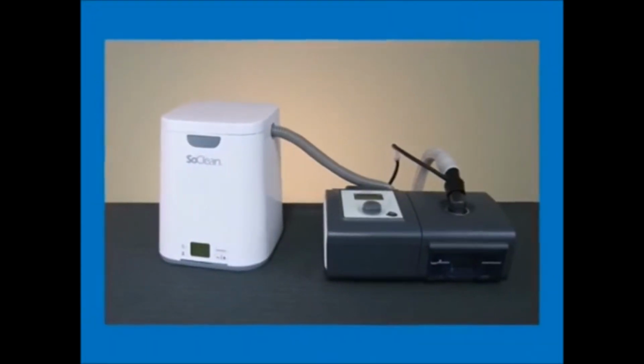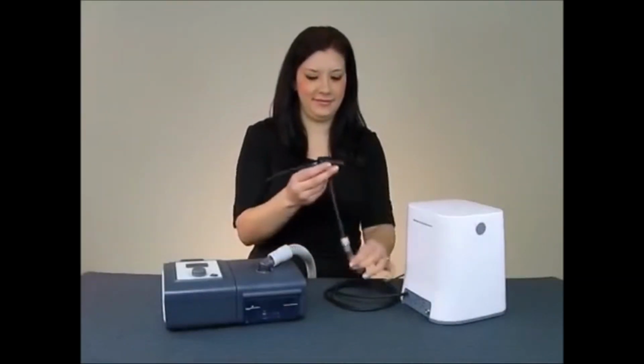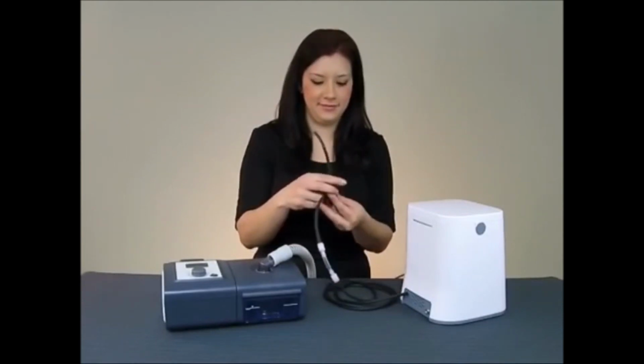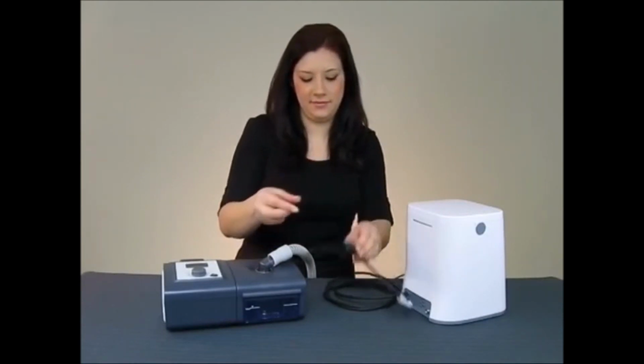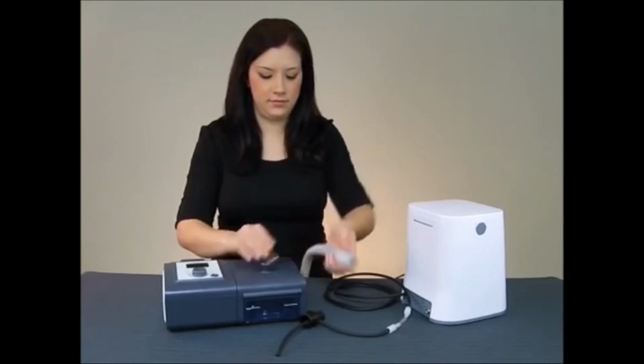The injection fitting establishes the link between the SoClean and your CPAP equipment. This fitting comes attached to the SoClean by a long length of hose. It also has a shorter length of hose coming from its interior. This shorter hose gets inserted into your humidifier tank.